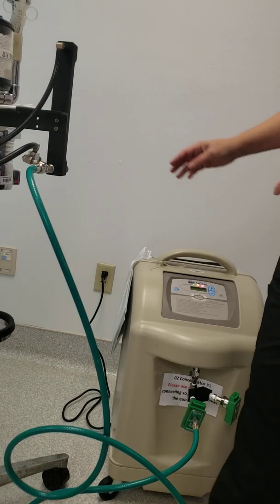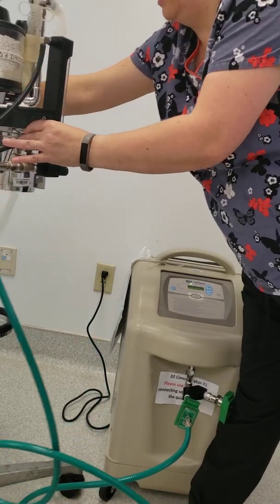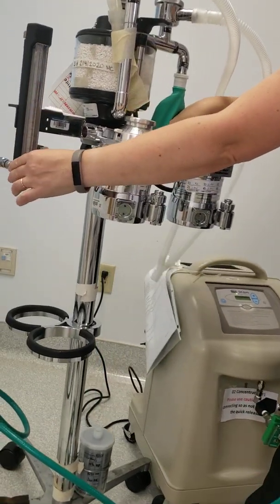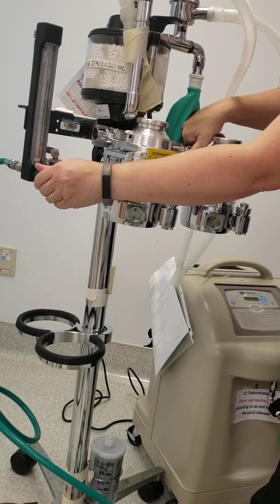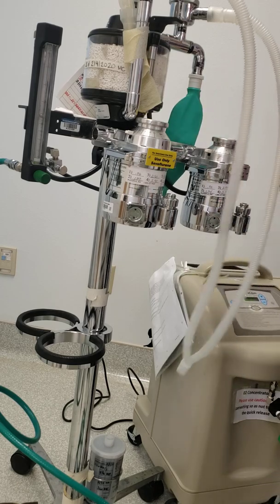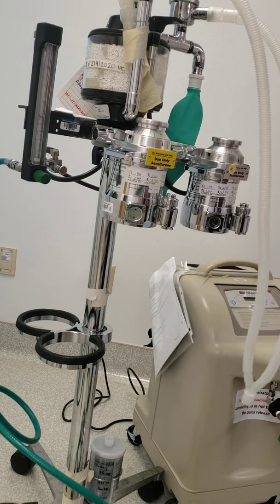In a few seconds you'll be able to look at your flow meter, and when you turn the dial you will have oxygen in your machine. And that is how you hook up your oxygen concentrator.